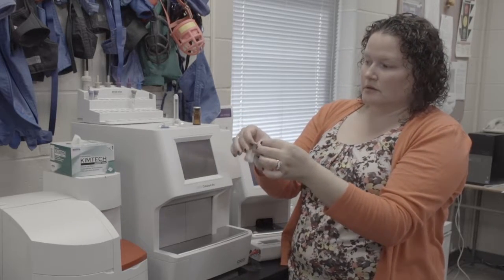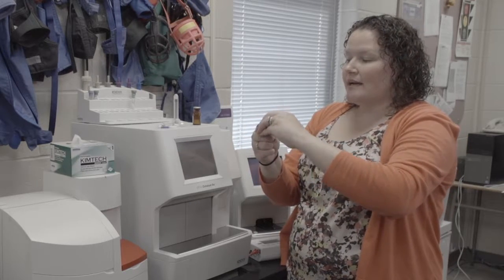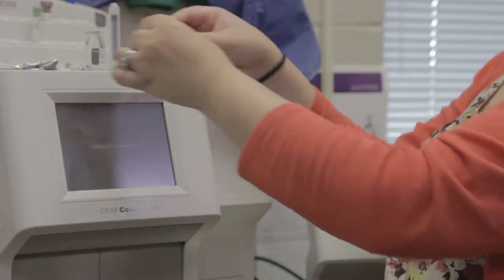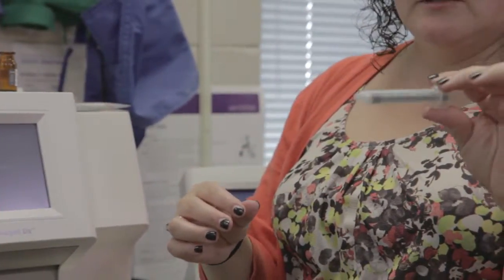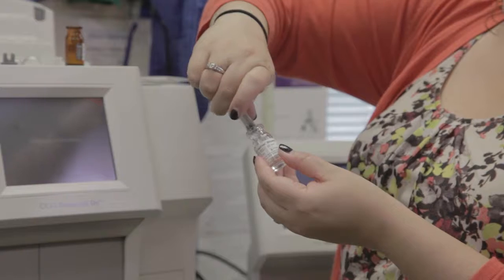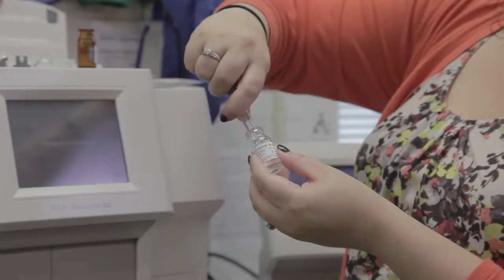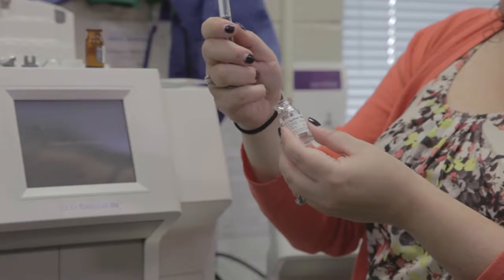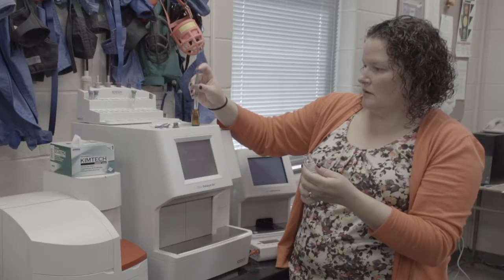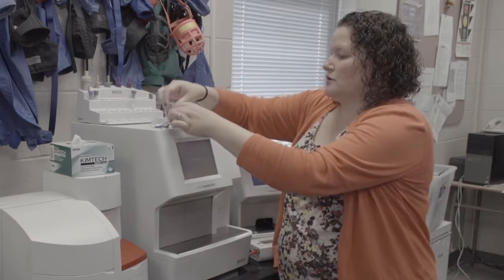Want to make sure that we mix our liquid. And we're going to take exactly 3 cc's of the clear liquid and put those into the powder. You want to use a 3 cc syringe with no needle. Let me get any air bubbles out. Okay. And then we're going to put the rubber stopper back on the amber vial and we're going to mix this. Give it a good 10 inversions. So now this needs to mix for 45 minutes before you can run it.